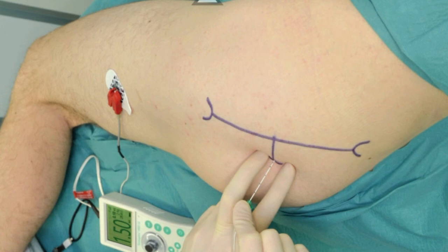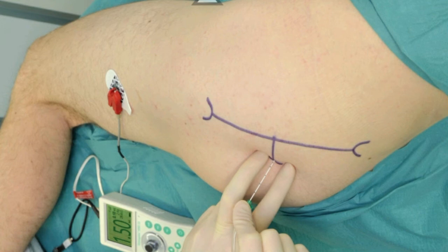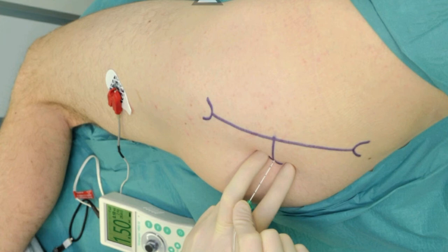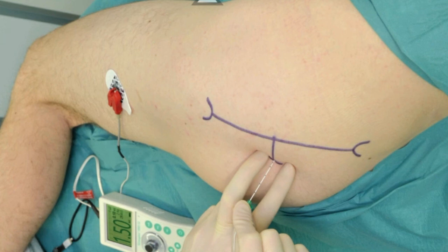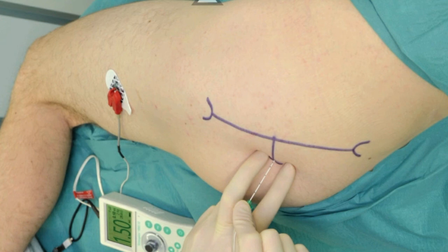The nerve stimulator should be initially set to deliver 1 to 1.5 mA current to allow detection of twitches of the gluteal muscles and stimulation of the sciatic nerve. As the needle is advanced, the first twitches observed are from the gluteal muscles, which merely indicate that the needle position is still too shallow. The goal is to achieve visible or palpable twitches of the hamstrings or calf muscles, the foot, or toes at 0.3 to 0.5 mA current.